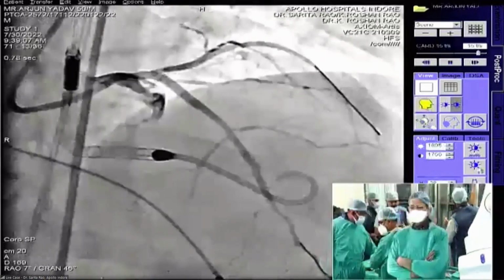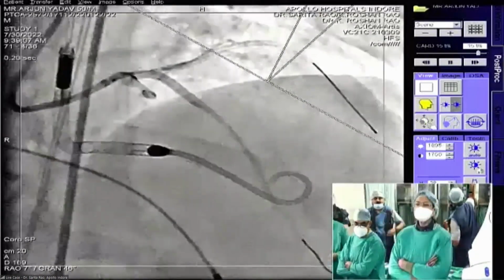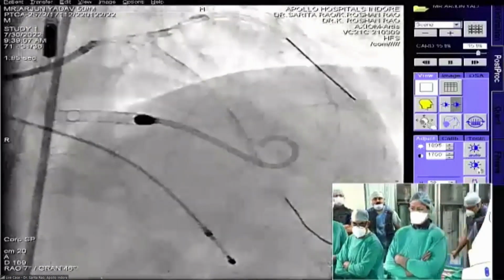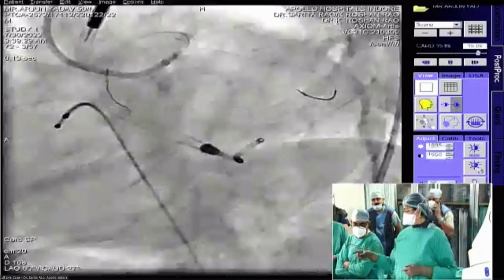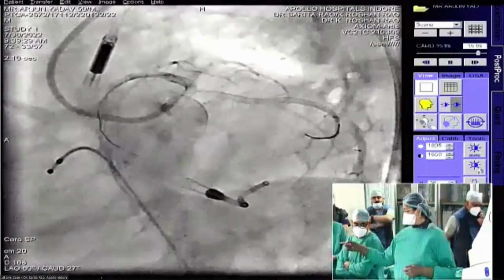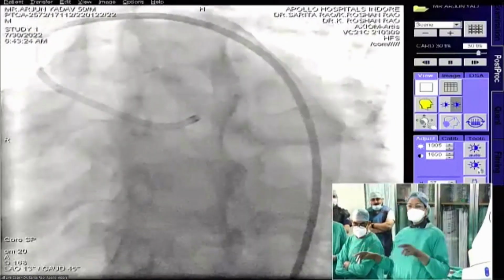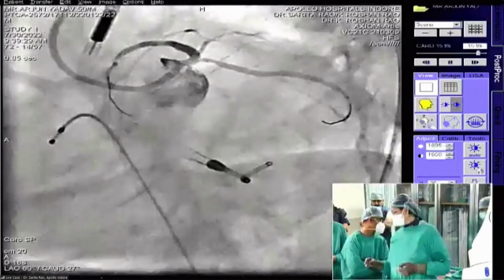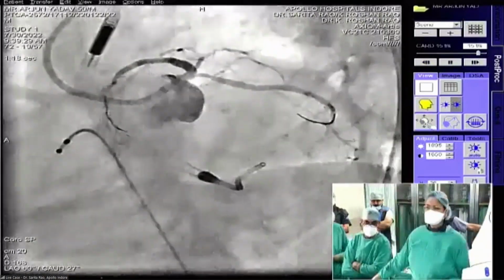Ramesh, more than that ostium thing, in the left main, that stent at that point looked slightly less compared to LAD. You need more dilatation of the left main portion, a bigger balloon. Right. So, madam, in this scenario, is FFR helpful for the circ compromise? Yes, FFR will come negative definitely. The only question is whether you want to separate the struts from the ostium, that school of thought. Otherwise, as Ramesh said, it's not absolutely indicated.